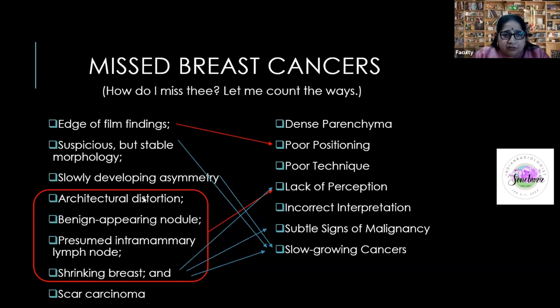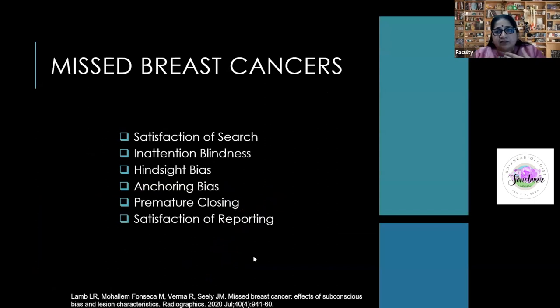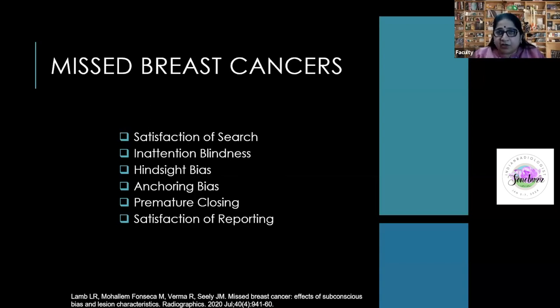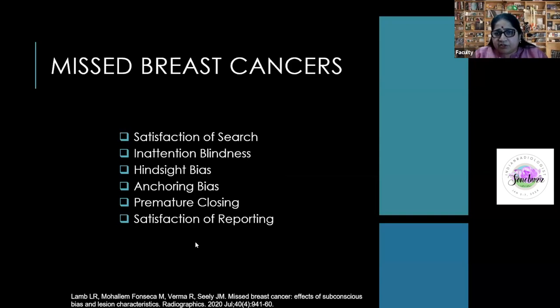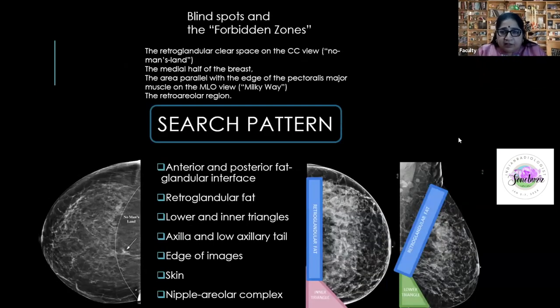Suspicious but stable morphology and subtle findings are another category. Then there are fixed thought processes — on ultrasound, finding one finding and ignoring the rest of the mammogram (satisfaction of search), or inattention from lack of focus. You must read in a dark, quiet room. Fixed thought processes — assuming that because a patient has had multiple normal mammograms, this one will also be normal — can lead to missing cancers.